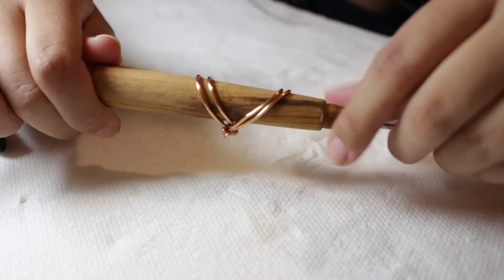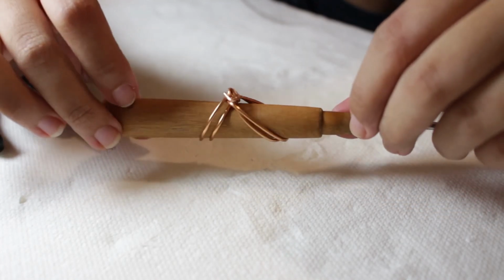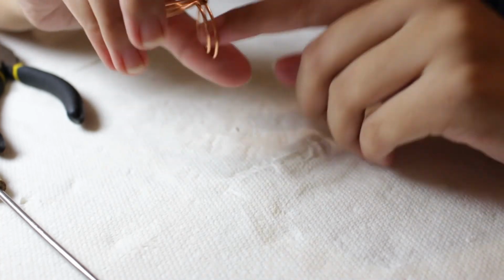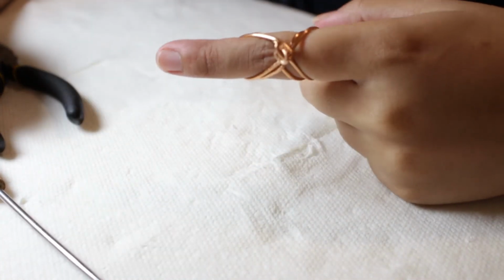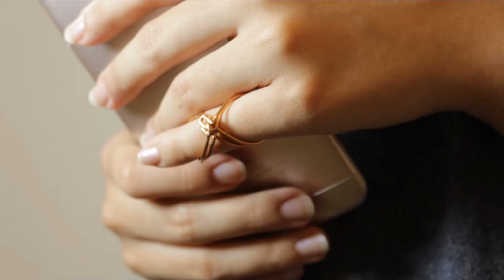So there you go. That's my ring version of an extension splint. Make sure that when you're wearing the ring, the knot is on top of the joint and the loops are around the belly to keep it secure. So there you go. Those were my extension splints.